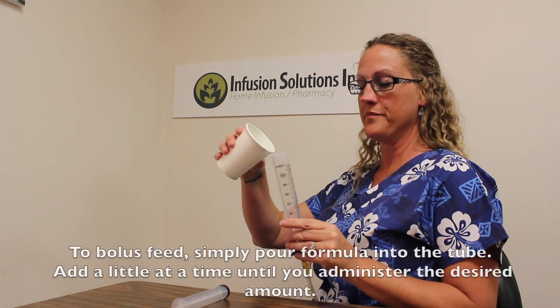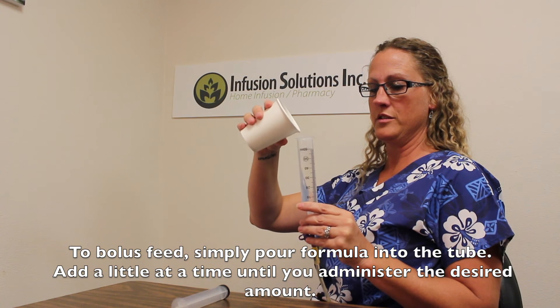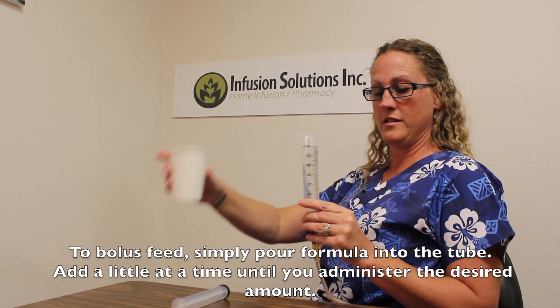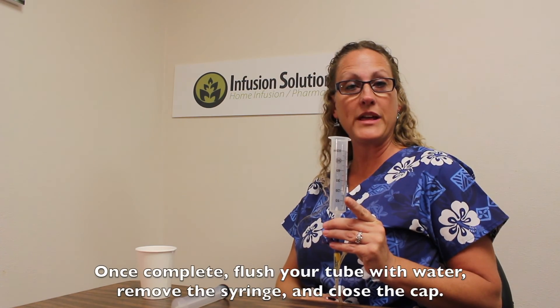So after you've flushed your tube, you're ready for your bolus. Get your formula, you'll pour it into your tube. We'll just keep adding little bits before it gets empty. Once your tube feed has completed, you will flush your tube again.